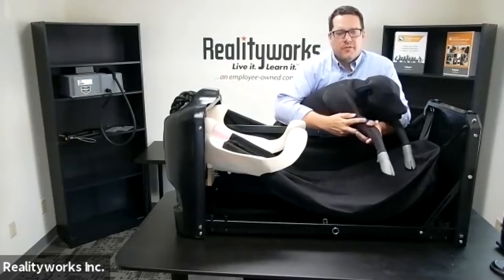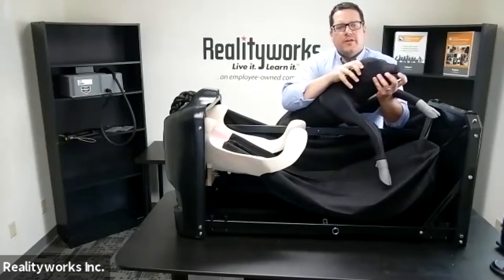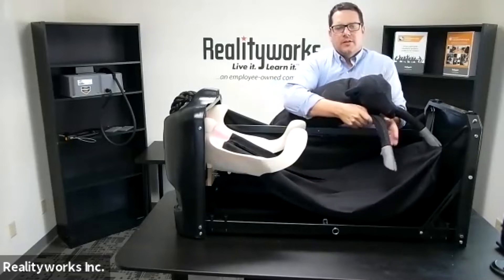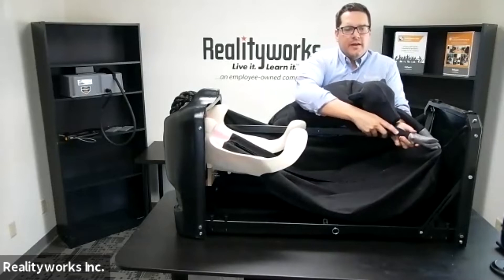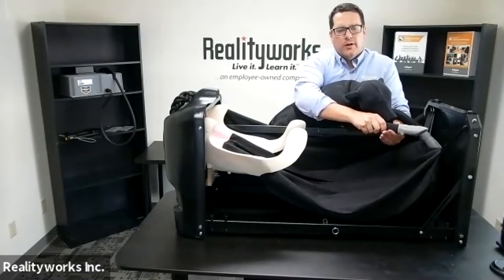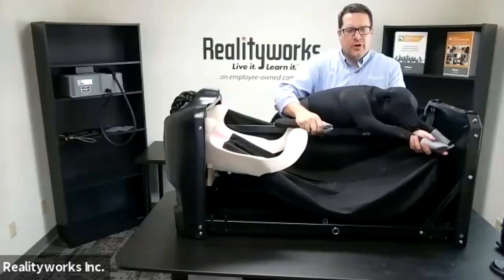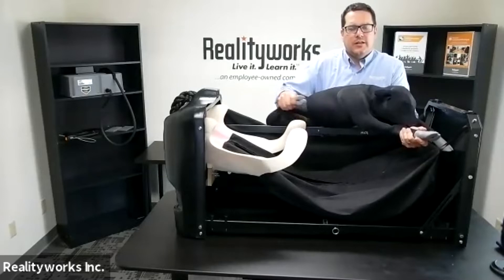Some features of our calf include the head with ears, and the mouth has an opening so you can put a harness on it. The legs come down with hooves that allow you to get a strap around them. All four hooves have that feature so you can figure out whether it's the front or back end of the calf, giving you that tactile understanding and feel.